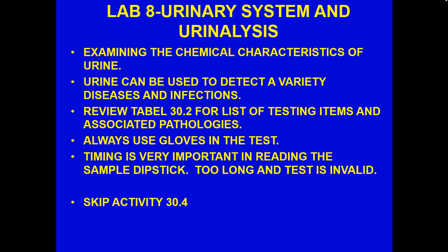But if you do it right, and I had seen some colleagues who were teaching students how to use this in an actual class, or I should say for their jobs, you have to be savvy. You have to be able to read it quickly, make the decision, keep moving upward, and rotating the bottle until you get to the next test, and to the next one, to the next one. How quickly are you supposed to be measuring, and how quickly are the times? 30 seconds, 40 seconds, 40 seconds, 30 seconds, 20. I think it goes to like 50 seconds, and then 1 minute, 1.5 minute.